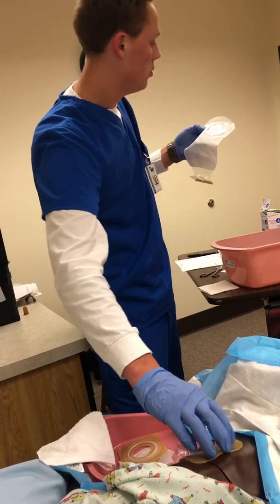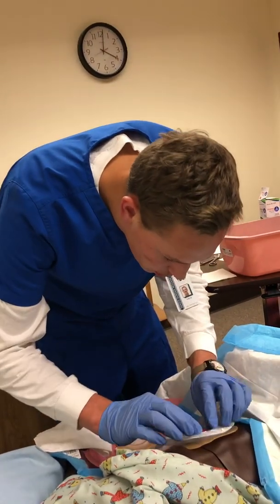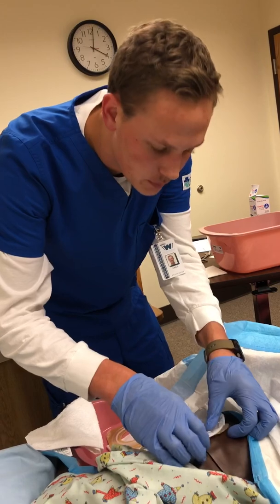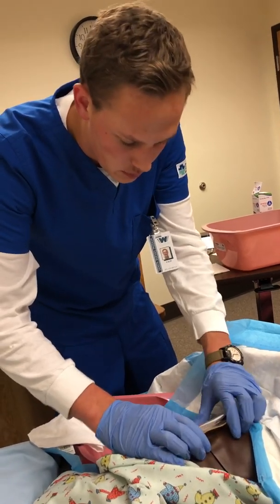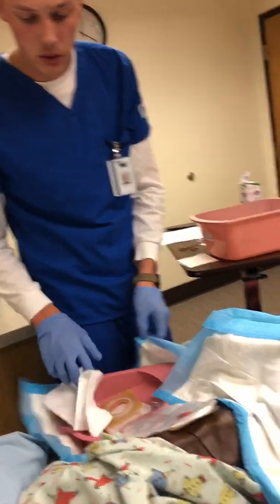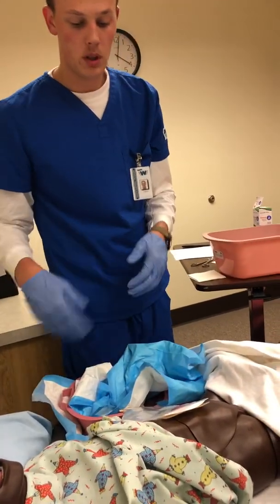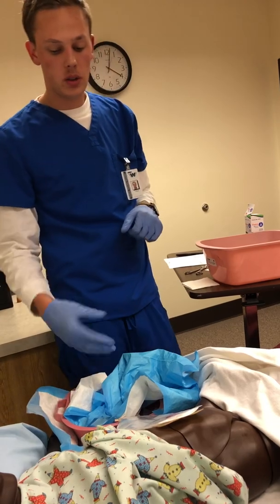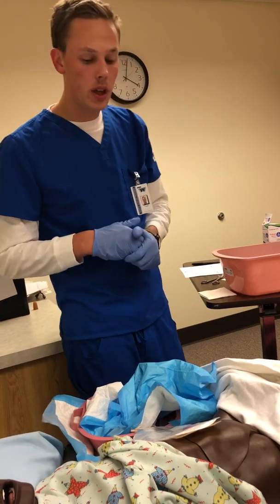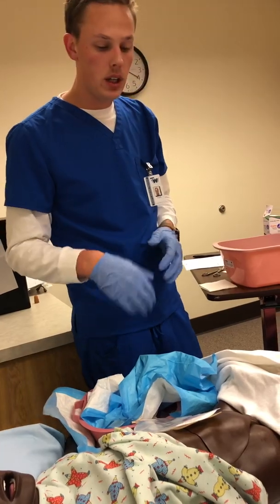And then with the new bag is when you will really put a push on it, just making sure it's sealed all the way around. And then I would discard the old bag and pouch per facility policy. When I took the old one off, I would have changed gloves and then redone hand hygiene and then put on new gloves and then cleaned the stoma and then put on the clean ostomy bag.